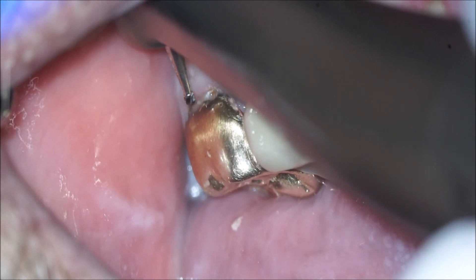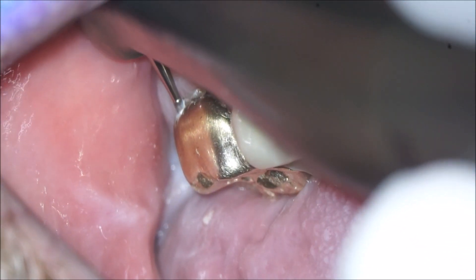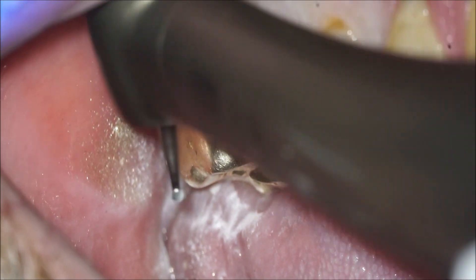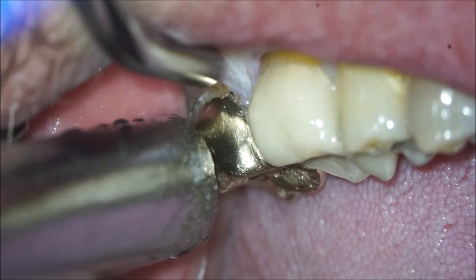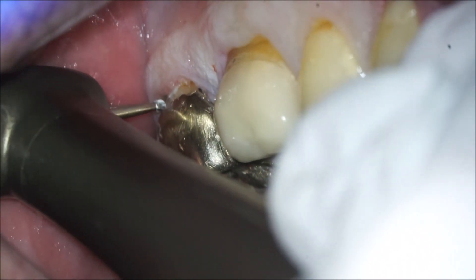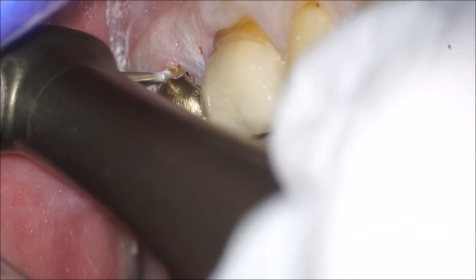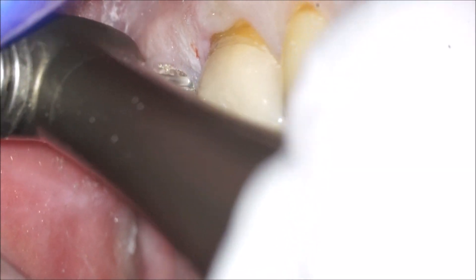I think amalgam is a great restoration to use in this type of situation. What I'm using is a number two round burr, and you might notice that I'm using no irrigation. One of the reasons is this is a difficult area to see — it's right in the patient's throat, so they're going to constantly need to close and get the water out. With a really small burr, if you don't put a lot of pressure and don't do too much at once, you can get away without irrigation without overheating the tooth.